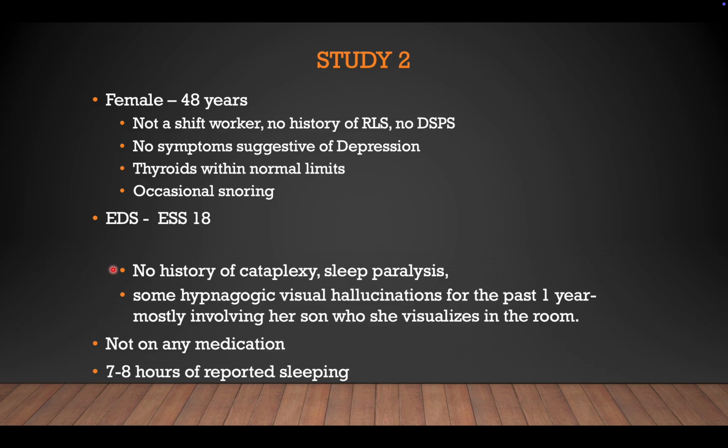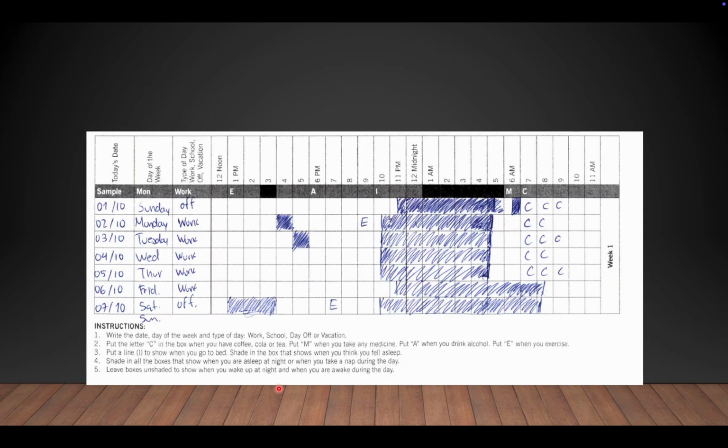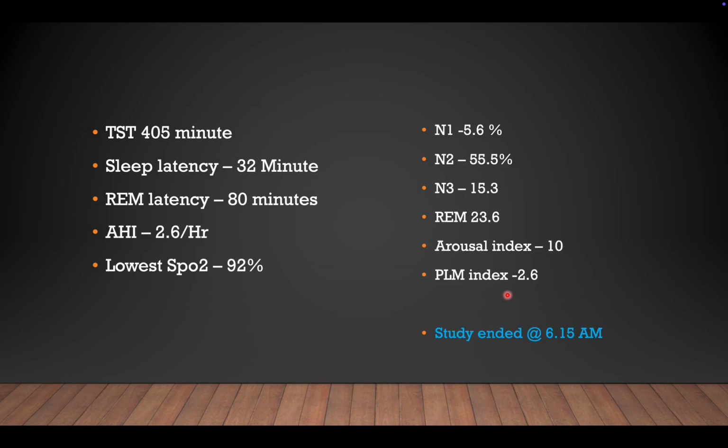Not on any medication. The patient claimed 7 to 8 hours of sleeping, and the sleep log was documented with some additional sleeping during weekends. The MSLT, PSG was done prior to the MSLT. Total sleep time of 405 minutes, almost 7 hours.